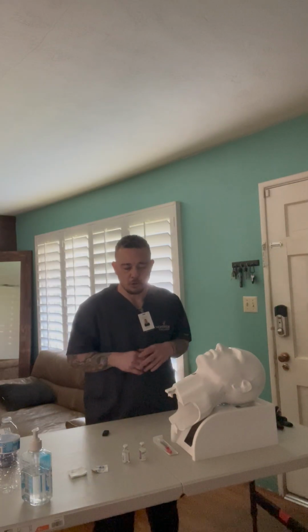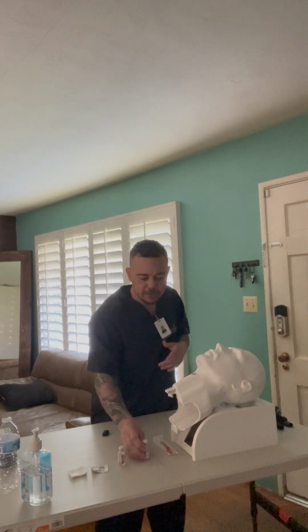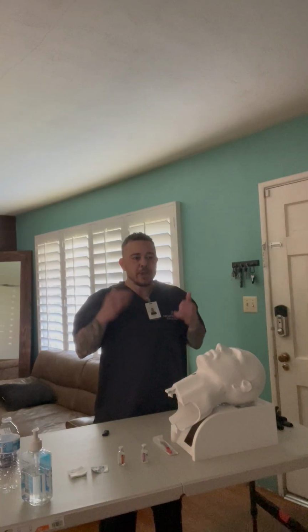Once I verify those pieces, I'm going to compare the provider's orders in the EHR to the MAR. And in the MAR, we have 4 units of insulin that we're going to administer to the patient, along with 8 units of NPH or intermediate insulin. Once those checks are done, I'm going to go into the patient's room.